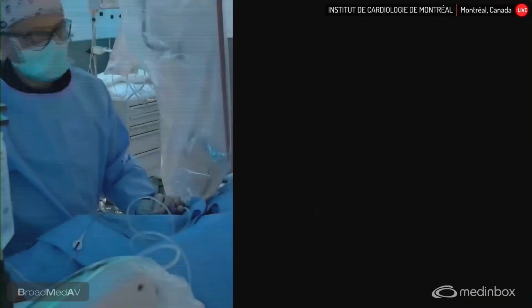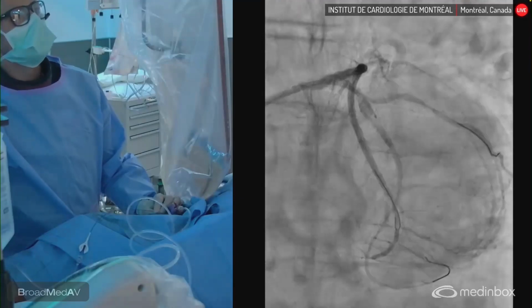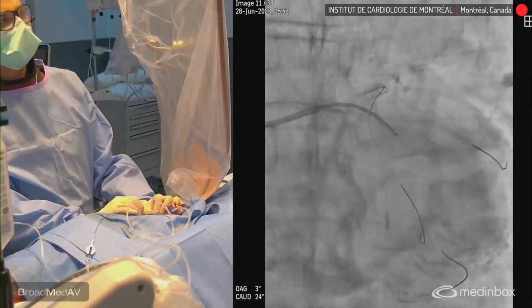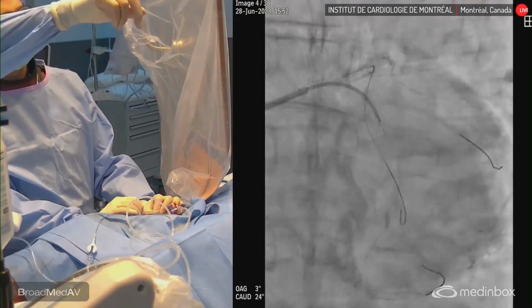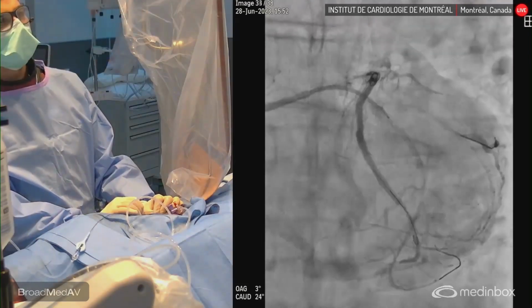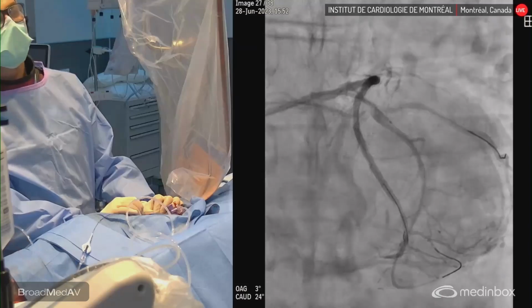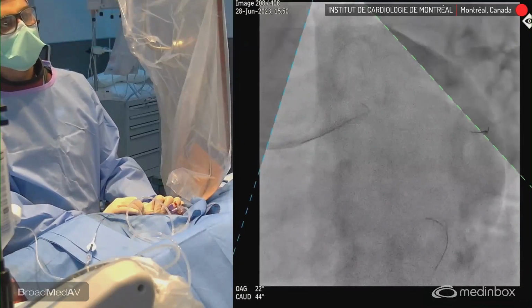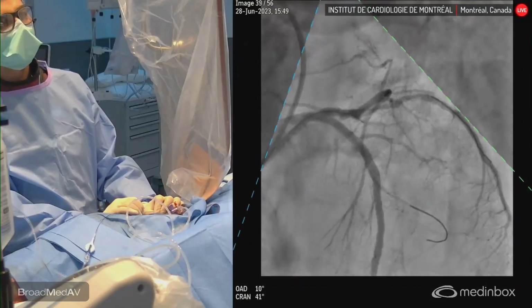Okay, I like that for that portion of the disease. Yeah, that's good. We have enough to do a pot. Do you want to check another view? The IVUS, or that's not the IVUS, the spider? There's some dissection. The spider. Yeah, maybe. Je pense qu'il faut qu'on ait plus de distance quitte à.